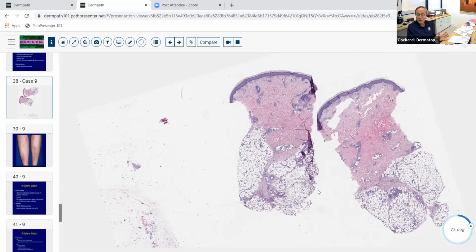panniculitis. So we've got two panniculitides today. We got two panniculitides and a fasciitis in one set of interesting slides. How about that? And if you did a shave biopsy on any of them, you're a wasteful person. You didn't help your patient one bit.